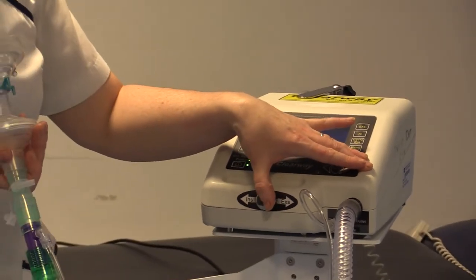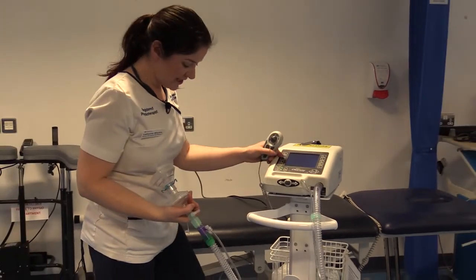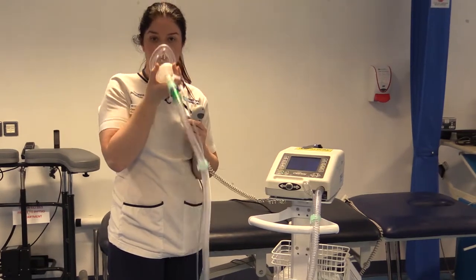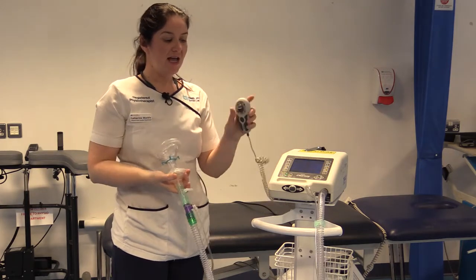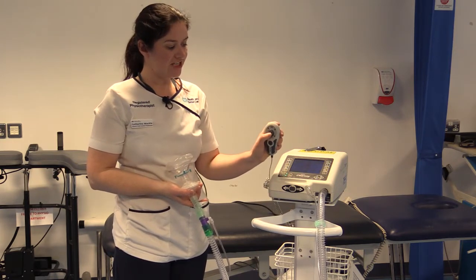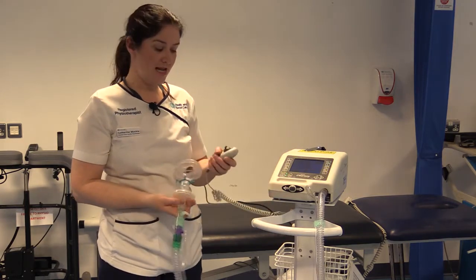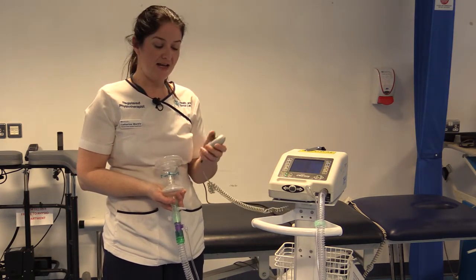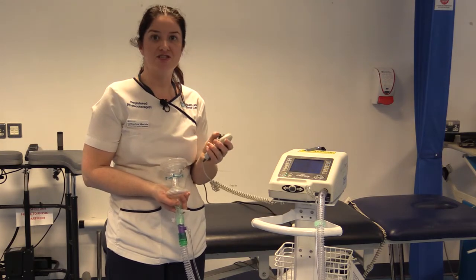Unlike the Emerson where you had to manually flick between insufflation and exsufflation, the benefit of this machine is that it has a hand-held device. There are brakes on it so you can lock it in position. You can position the face mask closest to the patient — ideally if the patient can hold it themselves that's great, if not you may need assistance to maintain a good seal over the patient's face. This means your hands are free to trigger insufflation, which is pressing up, and exsufflation, pressing down.